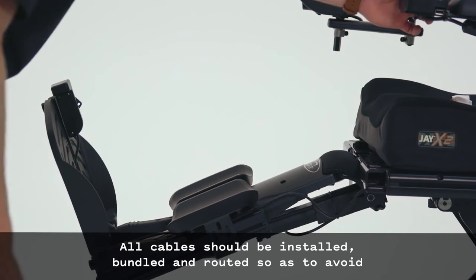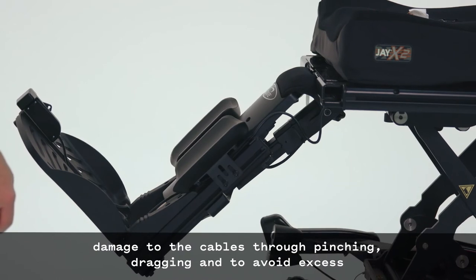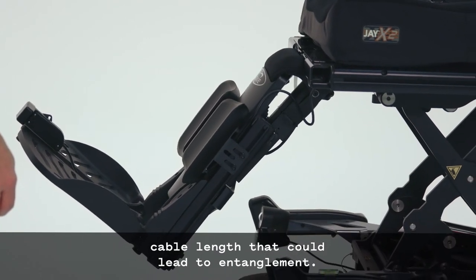All cables should be installed, bundled, and routed so as to avoid damage through pinching and dragging, and to avoid excess cable length that could lead to entanglement.